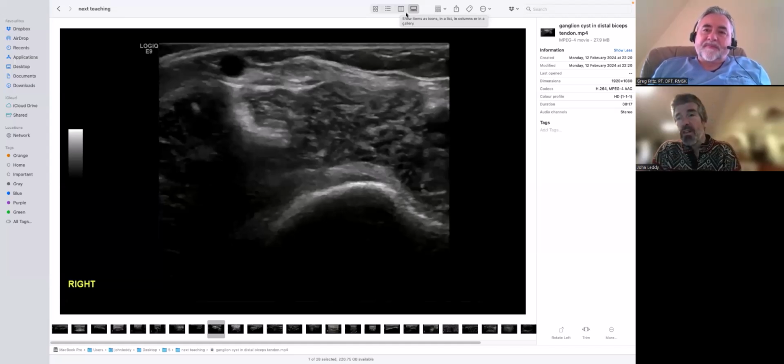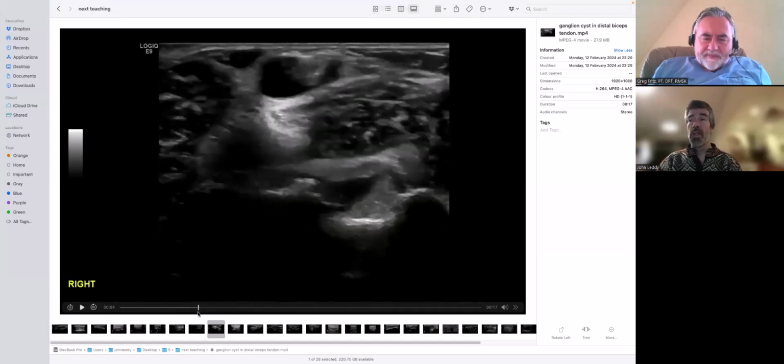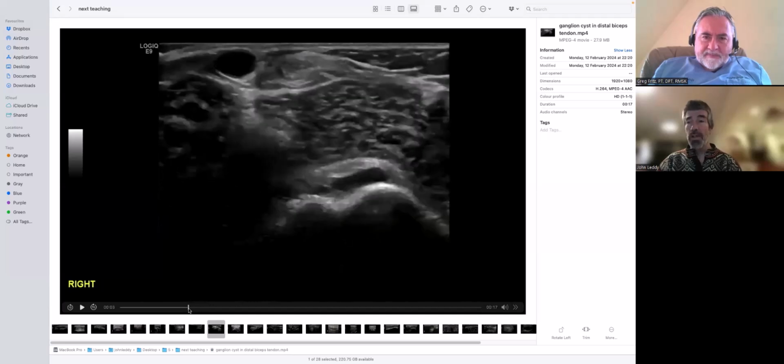If you're talking about specialty clinicians, I get a lot of referrals from specialty clinicians, a lot of them very experienced, and we still find that very much of what we see doesn't fit in with their initial diagnosis, which is why they send them for scanning. One thing I'm really pushing at the moment is trying to get people to look for osteoarthritis in the shoulder.